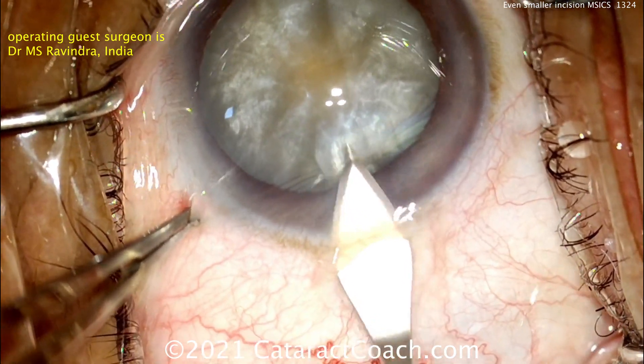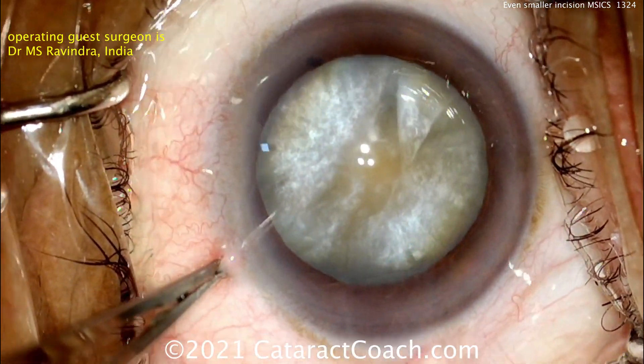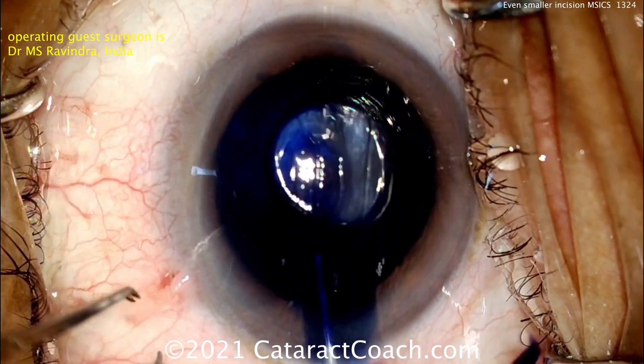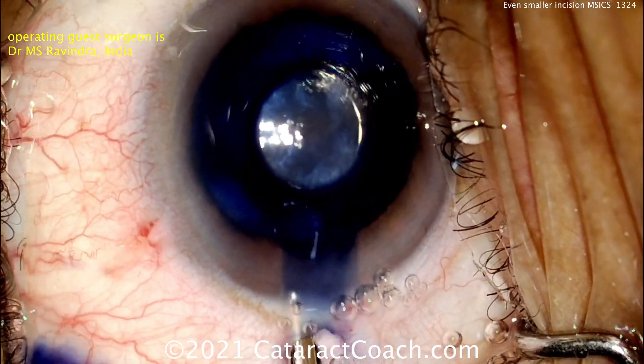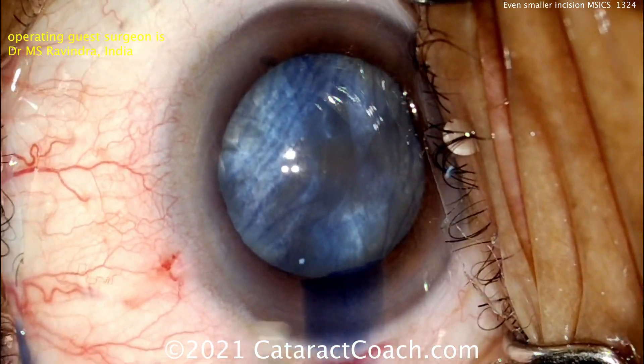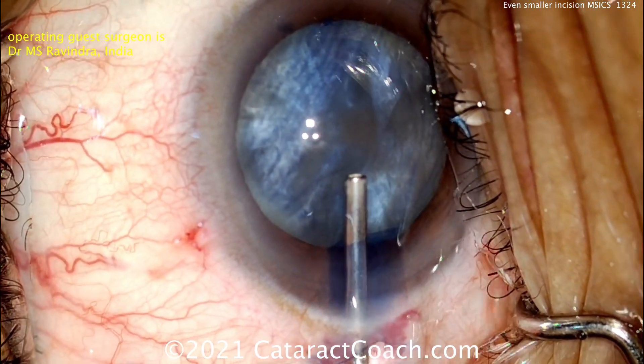He's sent us many videos in the past and he really does a beautiful job of SICS, including splitting the nucleus in the AC prior to removal of the halves. You can see there's the initial incision, probably about 2.8 millimeters wide. A little trypan blue dye going in. This is a real cataract.